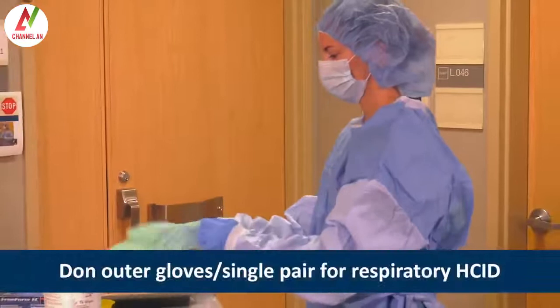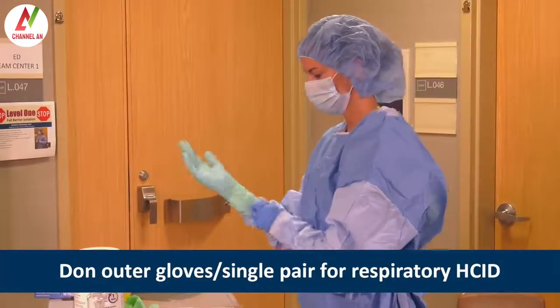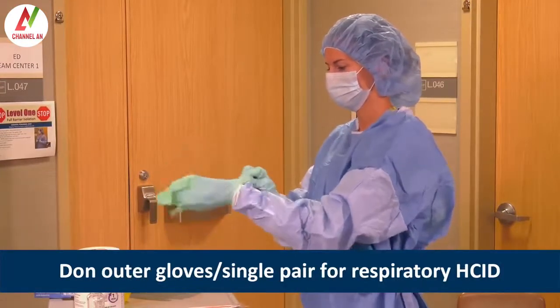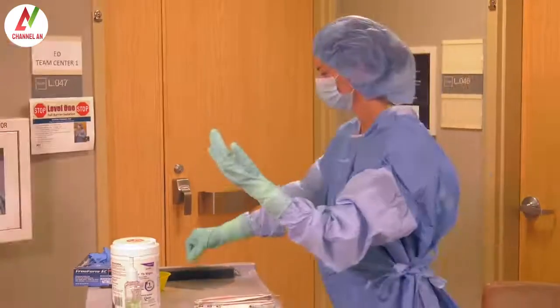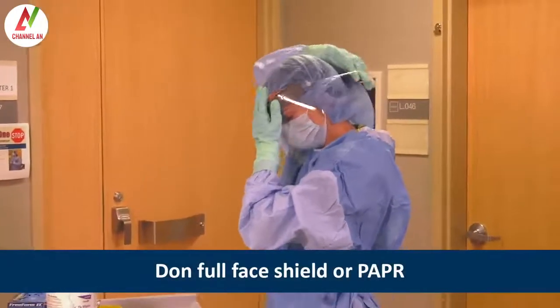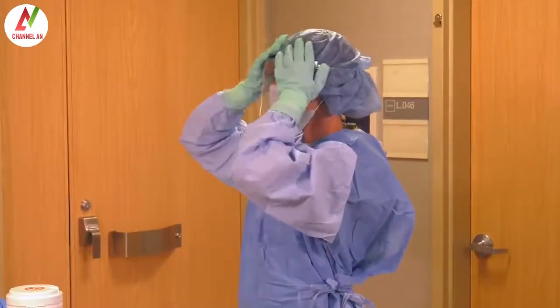She then dons the outer gloves and ensures the extended cuffs are pulled over the gown sleeves. This is where you would put on a single pair of extended cuff gloves for a respiratory HCID. Next, Heather puts on a full face shield over the hair cover and surgical mask or N95 respirator. This is where a PAPR with an integrated face shield would be donned.